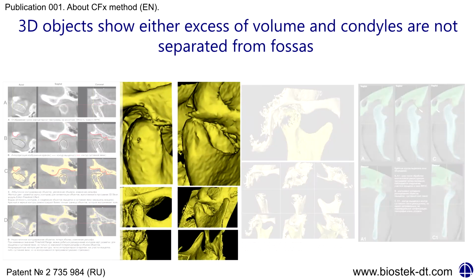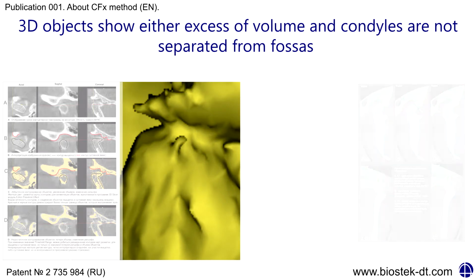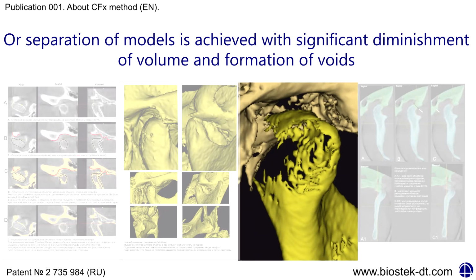3D objects obtained show either excessive volume and condyles are not separated from fossas, or separation of models is achieved with significant reduction of volume and formation of voids.